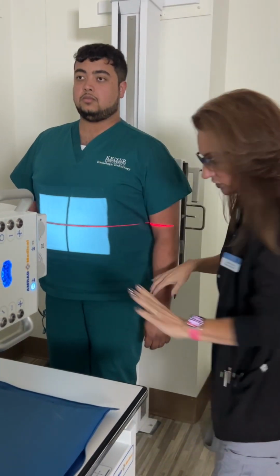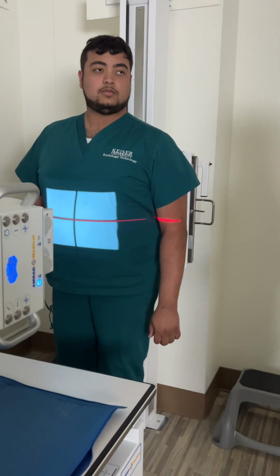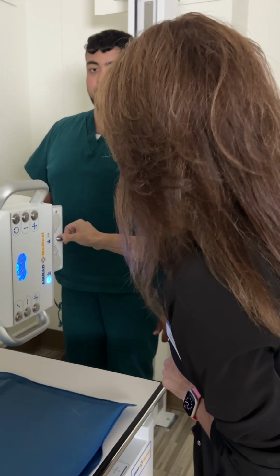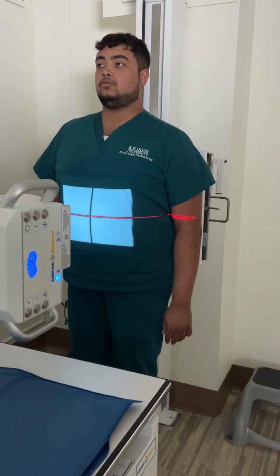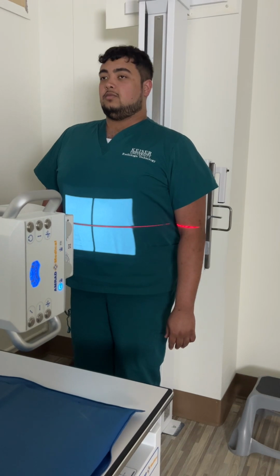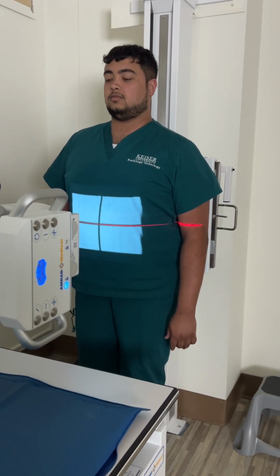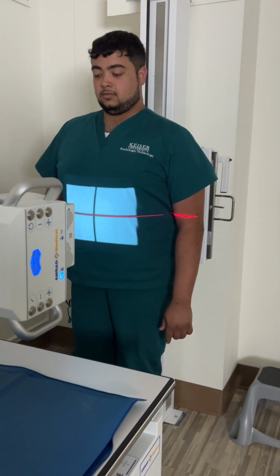We've got left marker on his left side, and I'm going to tell my patient, when I tell you, I want you to take in a nice deep breath, and then you'll blow it all out and hold it out. Okay? All right, just look straight ahead for me. Go ahead and take in a deep breath. Blow that breath all out. Hold it out. Don't breathe. Be good. You can breathe and relax.